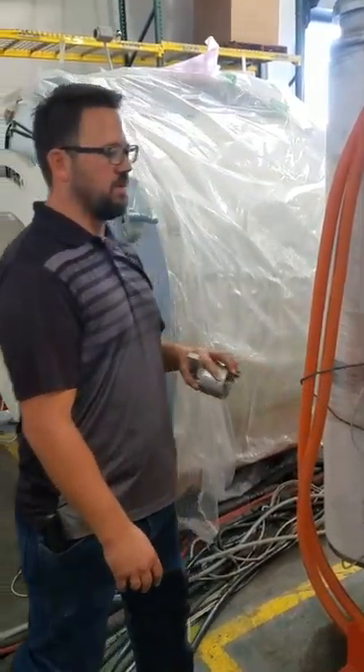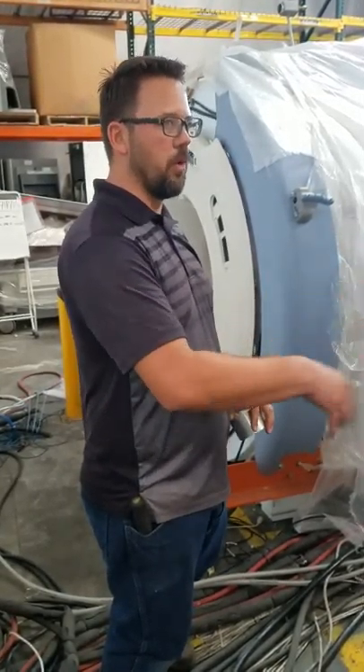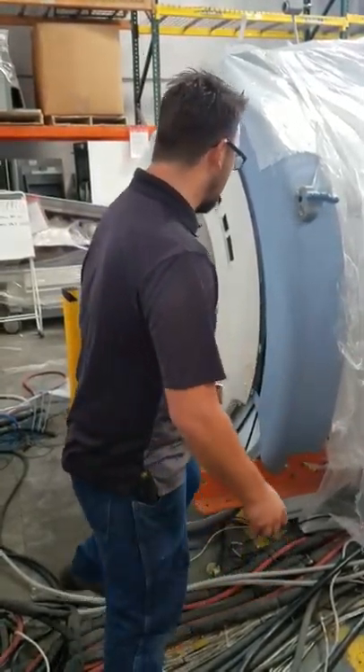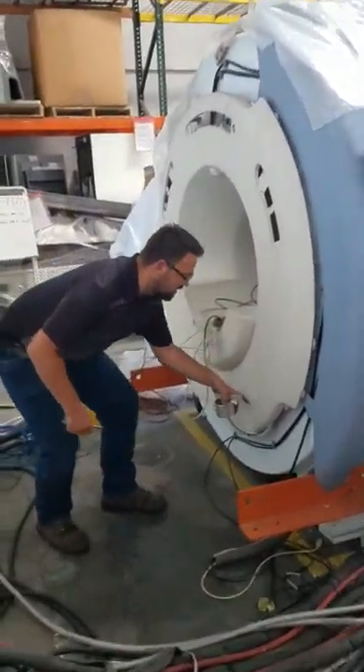For safety precautions, we always make sure that we pull a vacuum on our vessels before we strap them. We're going to do that on the HFO, but first I wanted to point out the LCC.